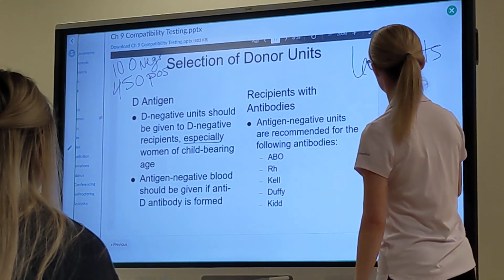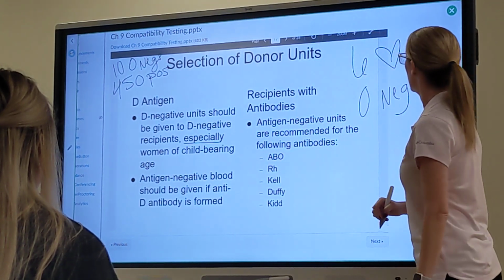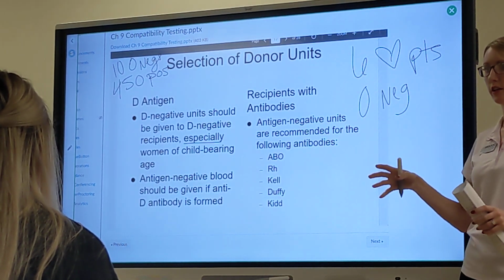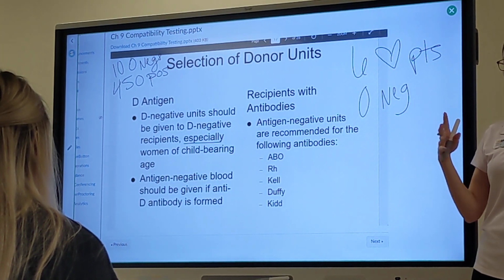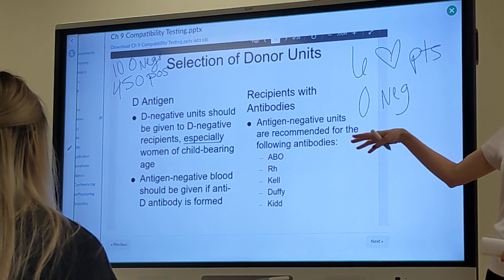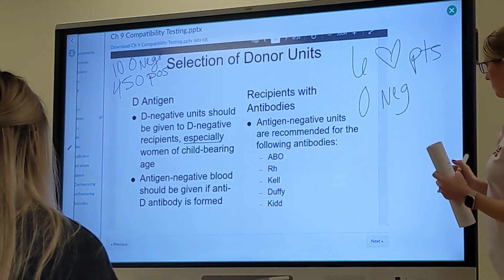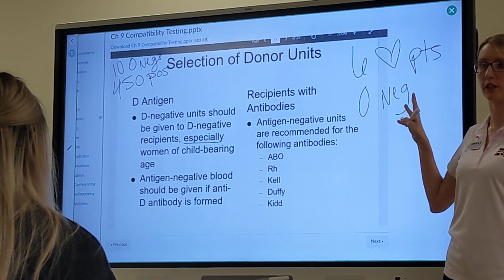We would send up 6 units, say the patient was O neg. When I say send up, our heart surgery was on the 3rd floor, and they had a blood storage refrigerator in there. Before a heart surgery, a perfusion assistant would come down and pick up the blood and put it in the refrigerator up there, which the blood bank monitored for temperatures and all that stuff, because nobody understands the blood bank stuff like you do.